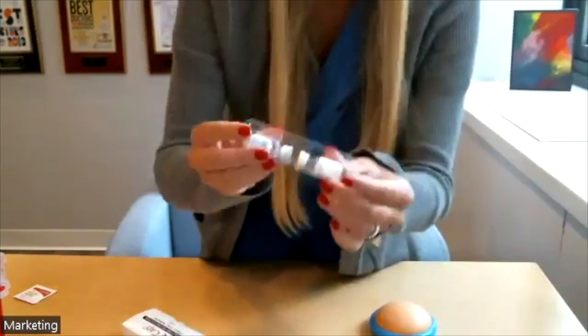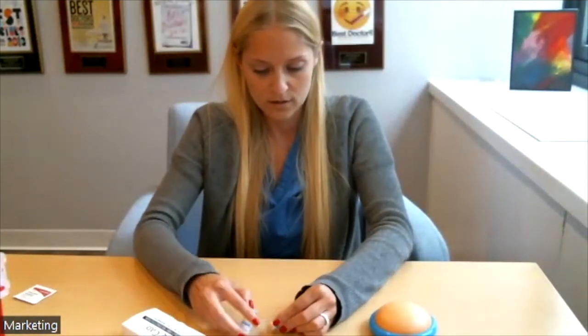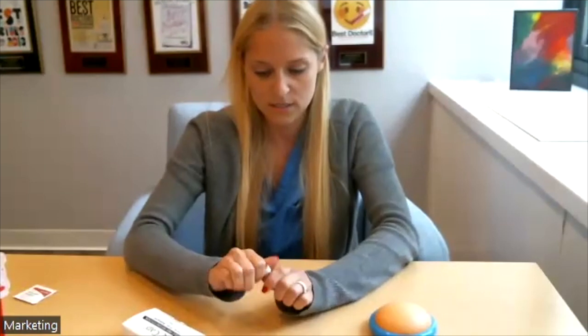We can move on to the third medication, which is Menopur. I'll show you how to reconstitute one powder vial of Menopur — the dose may change from person to person depending on ovarian reserve, but I'll show a one-to-one reconstitution. Each box of Menopur comes with five water vials and five powder vials. There are two ways to mix your Menopur: using a long needle that comes in your package, or using the Q-cap, which is a little more patient-friendly. I'll show you the Q-cap method.